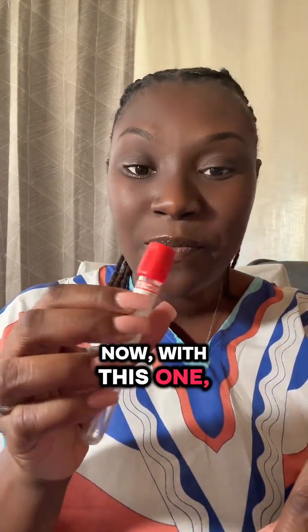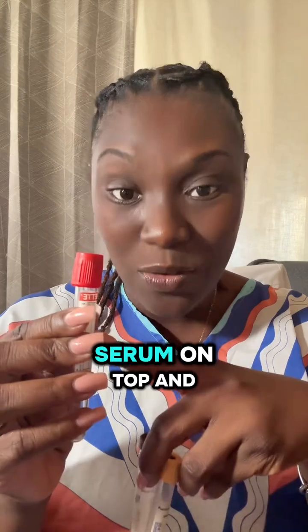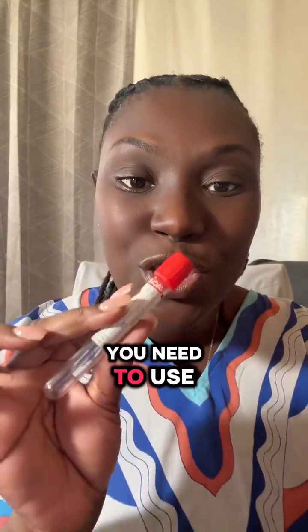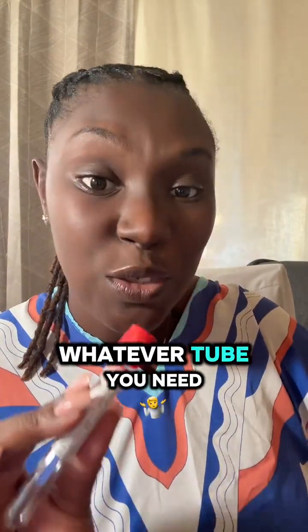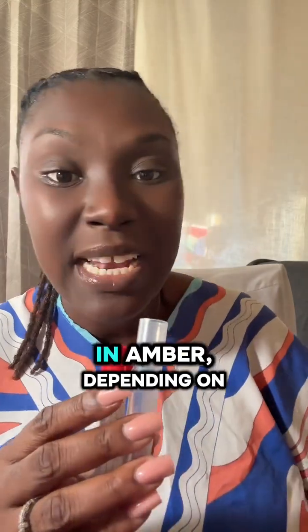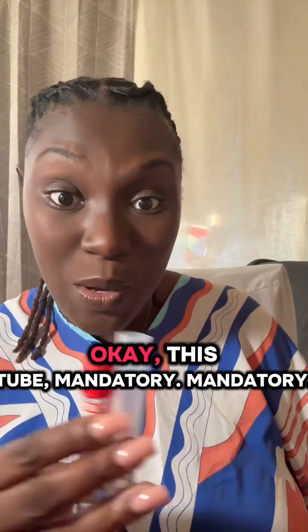Now with this one, because it doesn't have the gel underneath, you'll just see your serum on top and then the red blood cells on the bottom. Remember, when you're using the red top, you need to use a pipette to transfer it to whatever tube you need to transfer it to. So it's either going to be this one as your pour off, or it will be an amber, depending on what test is required. Okay?